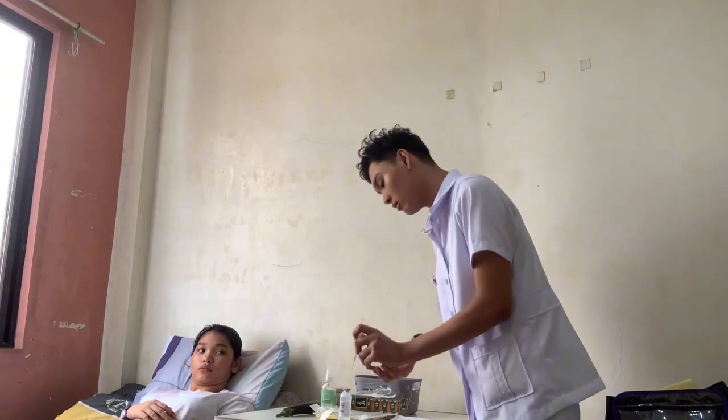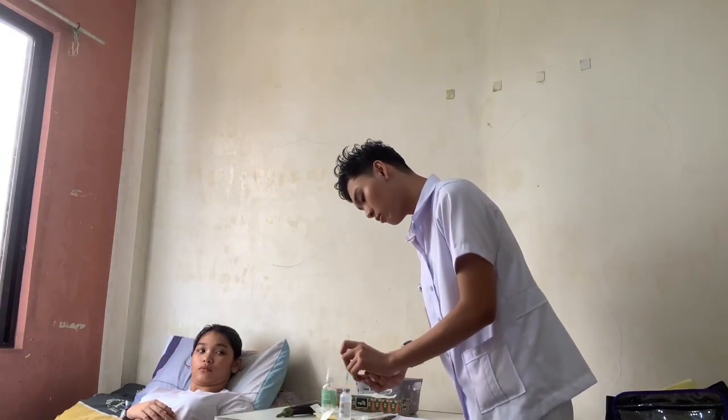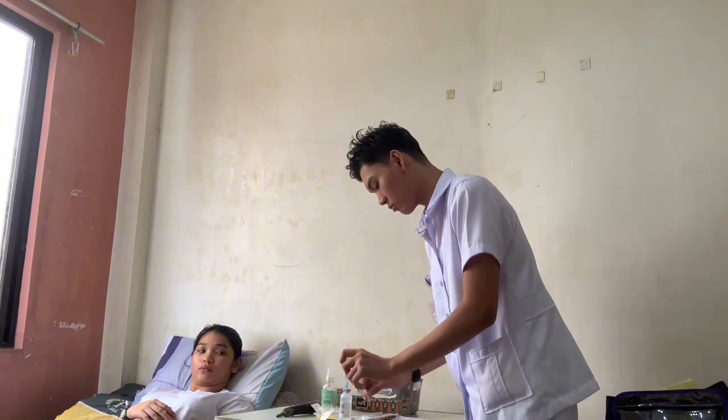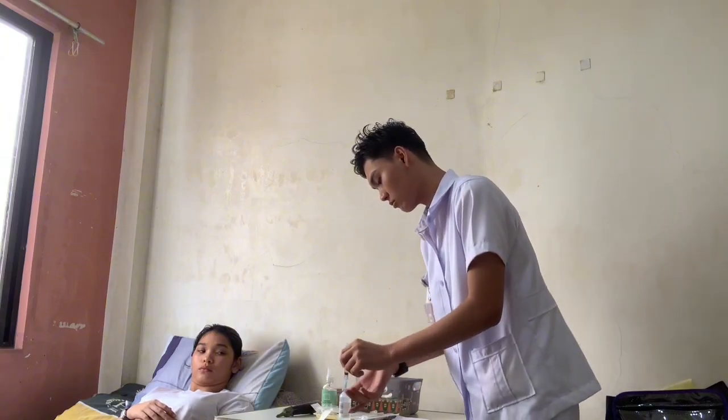I will remove the cap and aspirate. Now, I'm going to put the syringe into the vial. And then I'm going to invert, release the air.